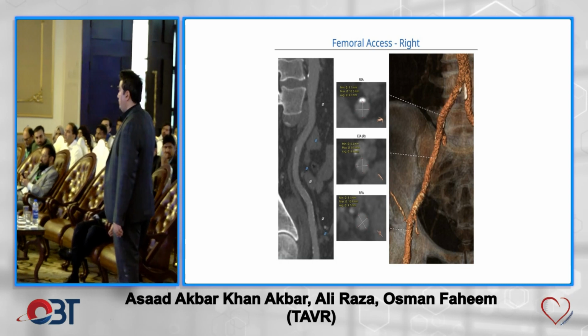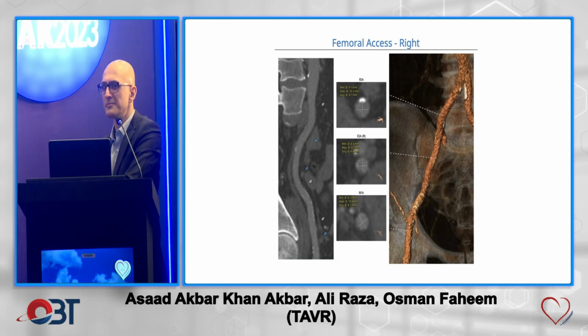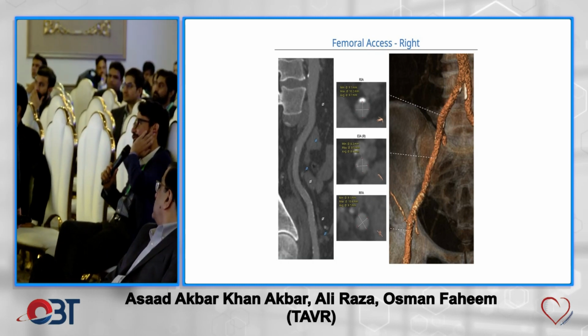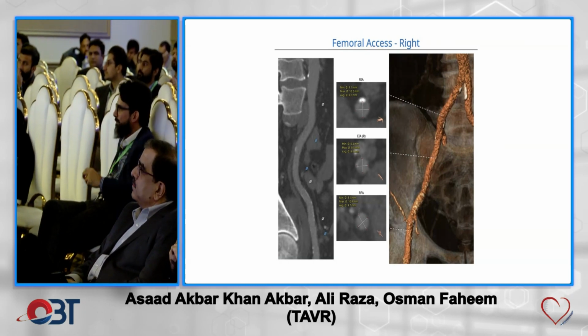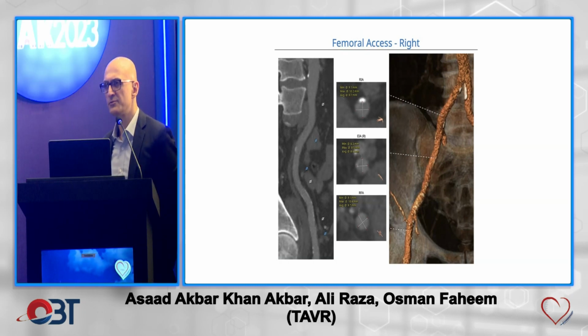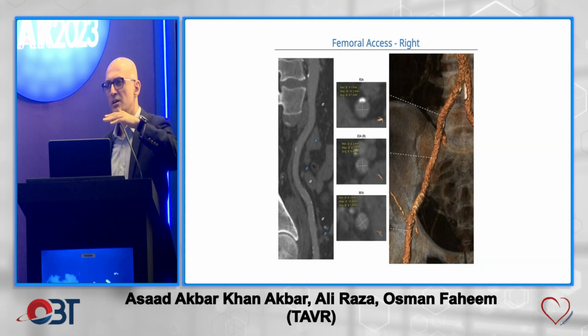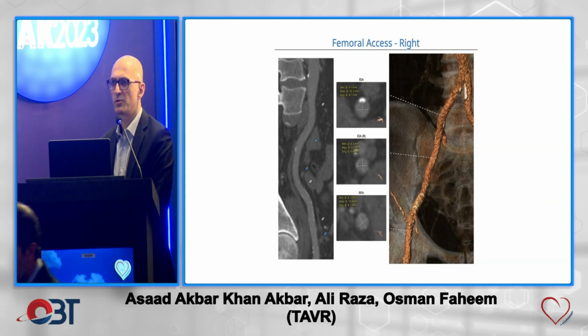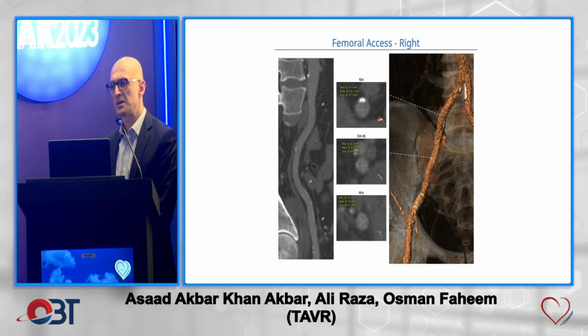Let me ask you this, Usman. For balloon expandable valves, have you started using cusp overlap? No. You still keep it in the right coronary and you go to the 3-cusp view. Yeah, and generally the valve, as you know, foreshortens a lot from below, so it's less likely that you'll end up very deep. And typically, you end up deploying about 80-20. And with the sealing skirt, you're less worried about leaving significant PVL also. So that's why the pacemaker rates have been lower, and I think the 3-cusp view works pretty well for balloon expandable so far.